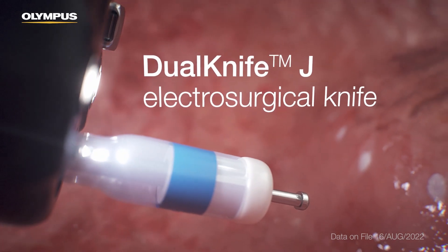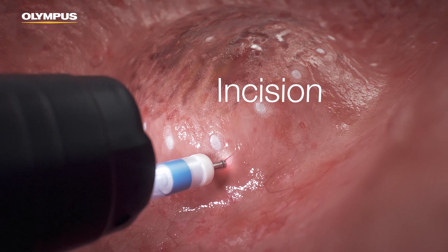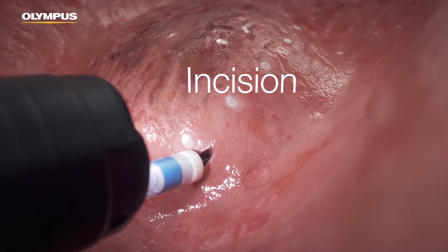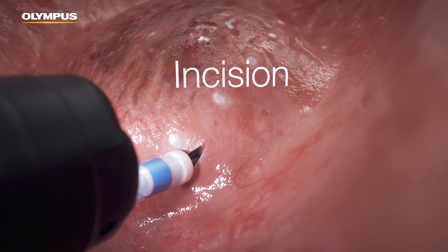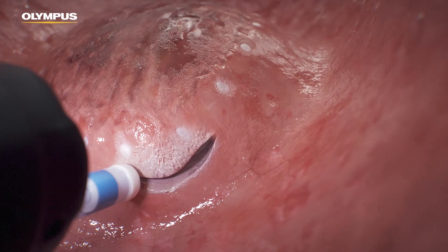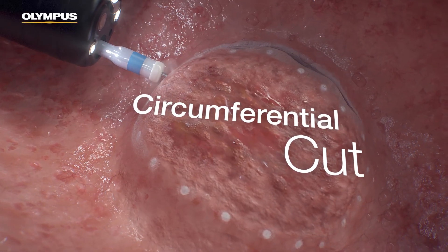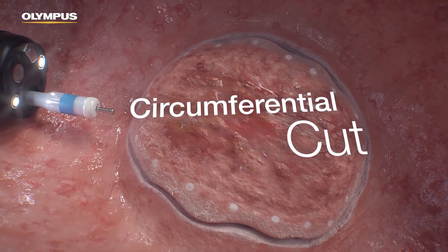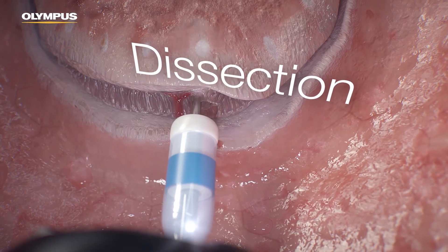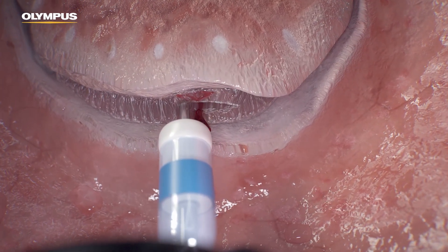EndoClot SIS does not leave artifacts that may cause abnormalities during pathological investigations. The Dual Knife J Electrosurgical Knife is used to make the first incision outside one of the markings, creating a point of access into the tissue and starting the circumferential cut. The knife is then guided through the submucosal space, maintaining a cutting plane parallel to the muscle layer.